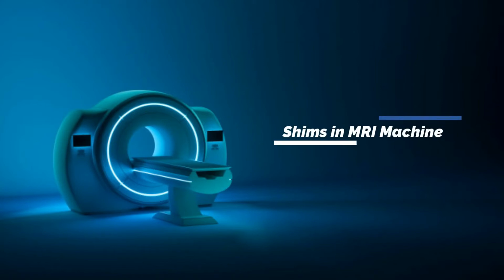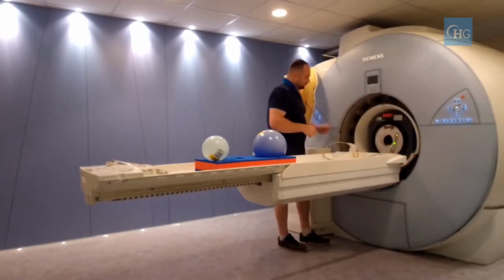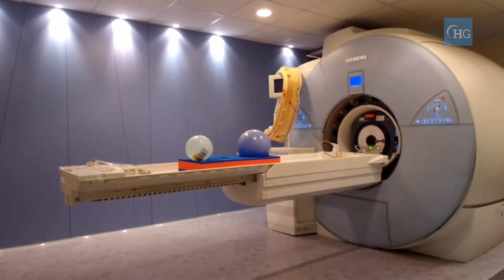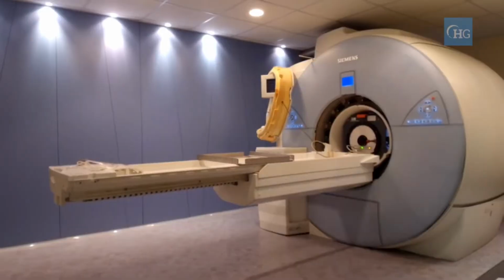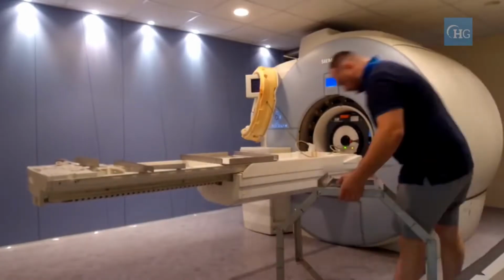The second component is shims in the MRI machine. When the MR scanner is placed in the hospital or clinic, its main magnetic field is far from being homogeneous enough to be used for scanning. That is why, before doing fine-tuning of the field using a sample, the magnetic field of the magnet must be measured and shimmed.